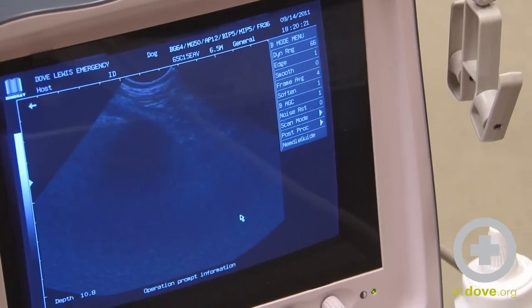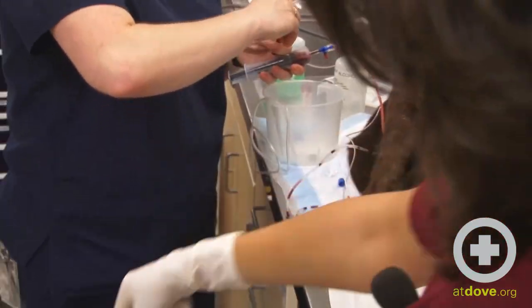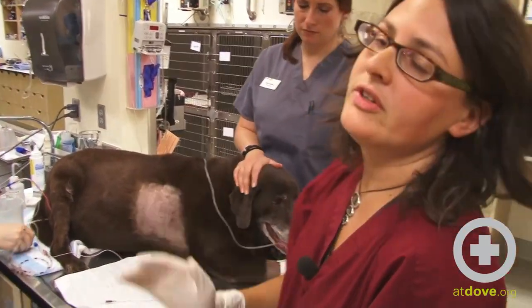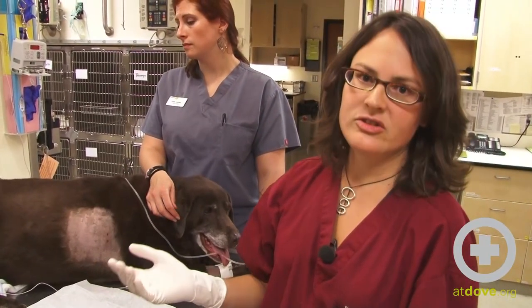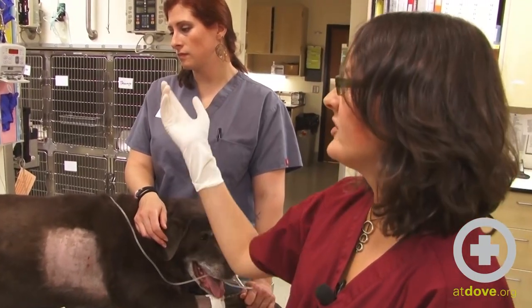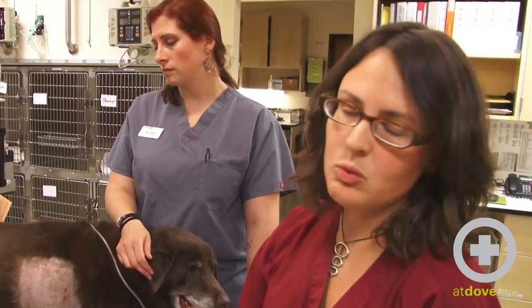So we have been successful with our pericardiocentesis. This dog will go to ICU where it will be monitored overnight on a continuous ECG. It's important to give fluids immediately after performing this procedure because the animal's hemodynamic state is so unbalanced — they've been in a level of shock while their heart has not been working properly. Right now this dog has bolus IV fluids, and then essentially she'll receive a workup to find out why she has pericardial effusion — so echocardiography, abdominal ultrasound, and coags are indicated. That's how we do a pericardiocentesis at Dove.